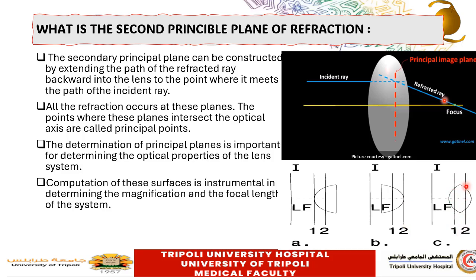Now what's important for us is the secondary lens plane, not the primary lens plane. The distance between this secondary lens plane and the iris surface is called the lens factor. So the first stage in the Barrett formula is to calculate the lens factor. Once we calculate the lens factor, it becomes easy to calculate the effective lens position and determine the lens needed for implantation. And this lens factor is dependent on the manufacturer because it is dependent on the A constant.